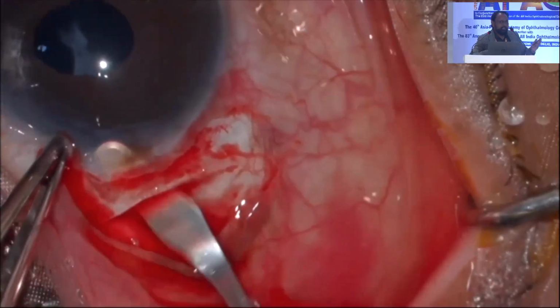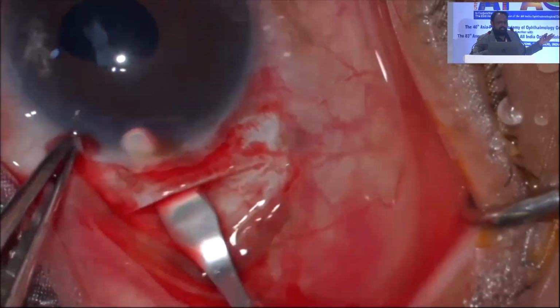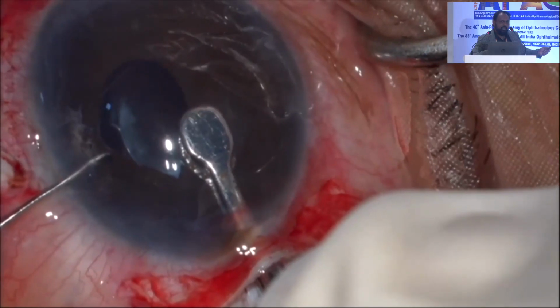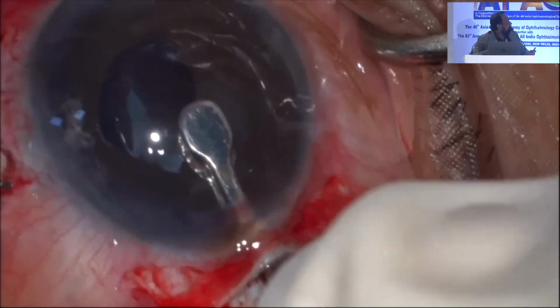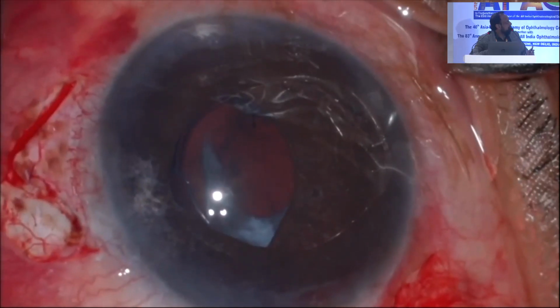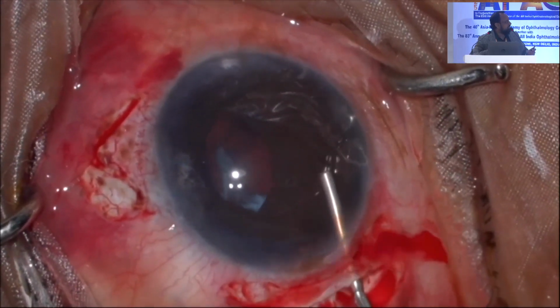You can use these lenses vertically also, because this was a case of long-standing aphakia with glaucoma. So the glaucoma surgeon did the trab superiorly, and we had to shift temporally to make the tunnel and do the claw lenses. In these types of cases, sometimes you get rigid pupils due to long-standing aphakia. So here again, don't be forcefully going inside, because that can damage the iris and we have had bleeding.